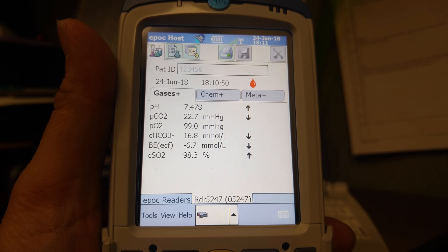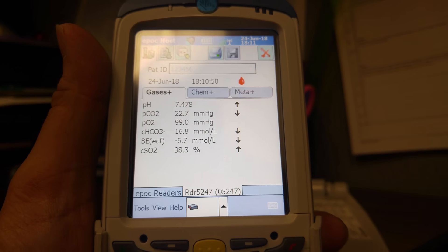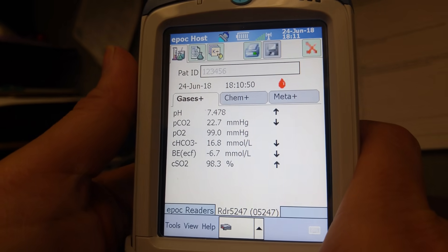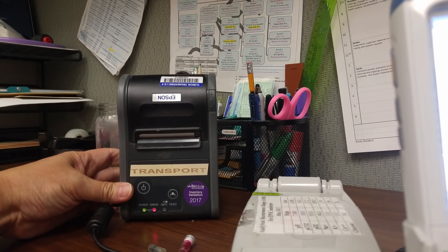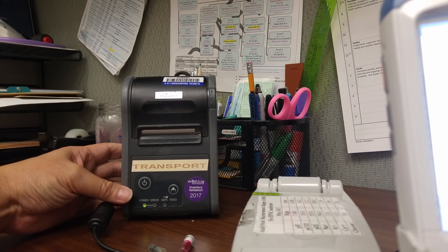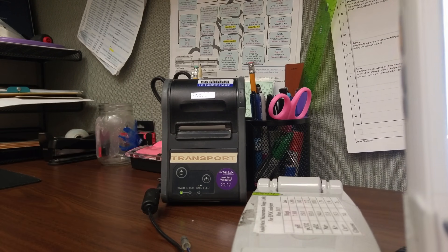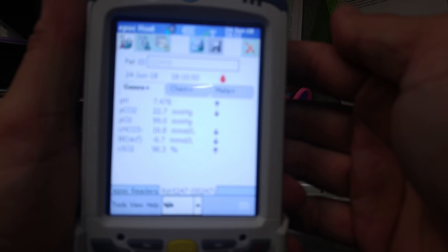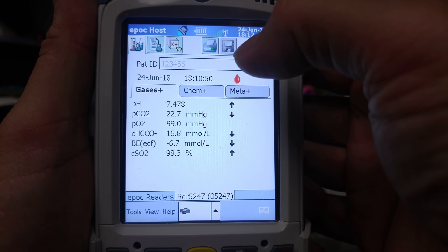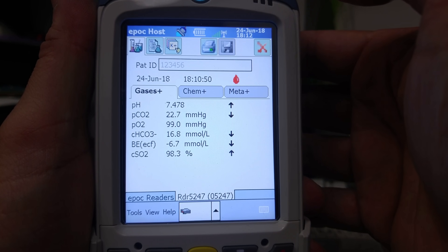So there's your result. So now you can also print this result out. You can turn it on, and on the machine, on the monitor, there's a printer icon. Press that printer icon.